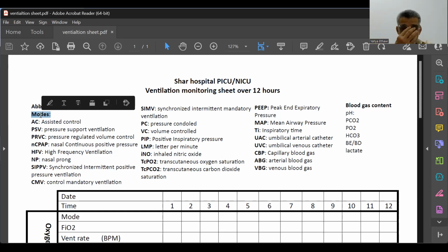Pressure control, volume limited. So we use both, pressure controlled, volume limited. There are mixed modes. So these are called control variables, which give us not the type of ventilation, while the modes depend on independent variables, dependent variables, phase variables, and the type of breath. Okay? Is it clear or difficult to understand?